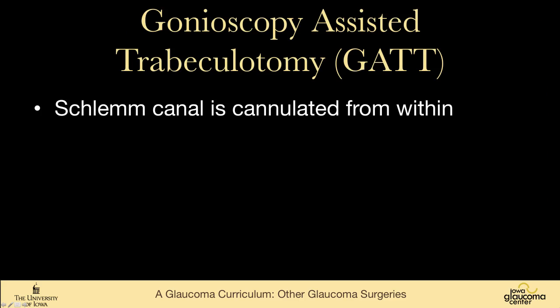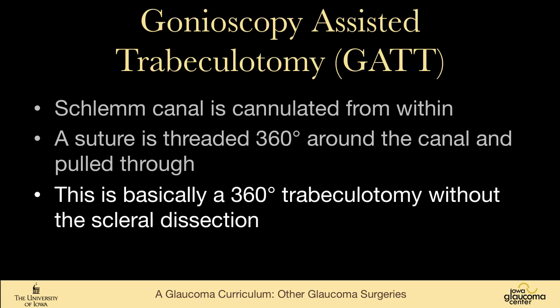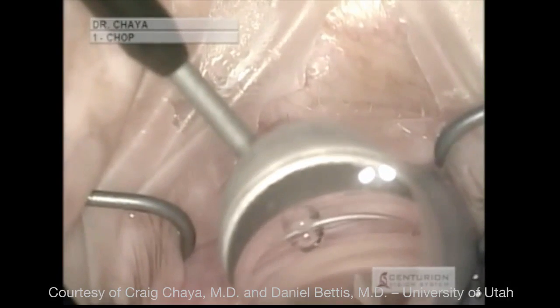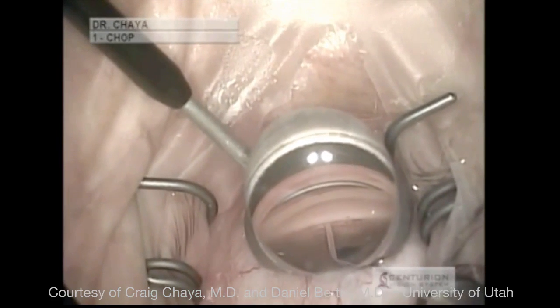An even newer procedure is gonioscopy-assisted trabeculotomy. In this procedure, Schlemm's canal is cannulated from within, sutures threaded 360 degrees around the canal, and then pulled through — just like a 360-degree trabeculotomy for congenital glaucoma. The difference is it's all done from within, so there are no conjunctival incisions — essentially a 360-degree trabeculotomy without scleral dissection. In this video from the University of Utah, an incision is made into Schlemm's canal and dilated with viscoelastic.